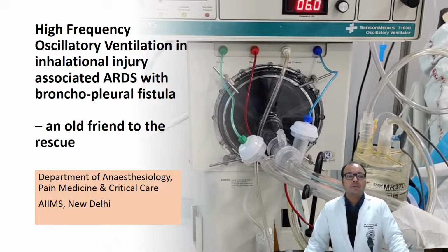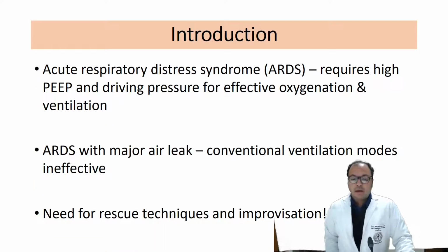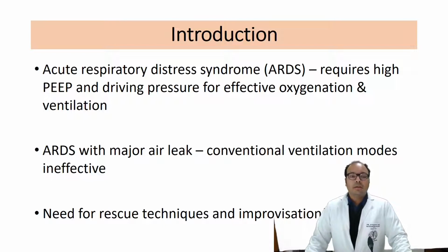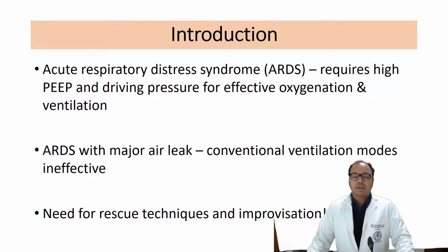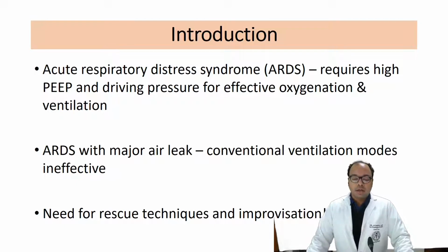I'll be presenting an interesting case of use of high frequency oscillatory ventilation in inhalation injury associated acute respiratory distress syndrome with bronchopleural fistula. Acute respiratory distress syndrome is a situation where we might need to provide high airway pressures and driving pressures in order to provide effective oxygenation and ventilation.